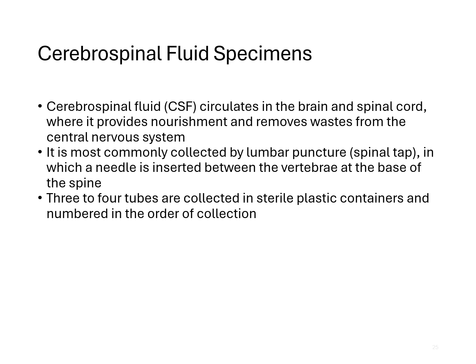Hematology testing is important to account for any peripheral blood contamination of the sample during the lumbar puncture, which would otherwise give misleading results. So we don't want to give the hematology department, who's looking for blood in the spinal fluid, number 1, because that was the one that happened right after the puncture. It could have a little bit of residual blood in there and could actually give false results. So that's why the numbers are extremely important.